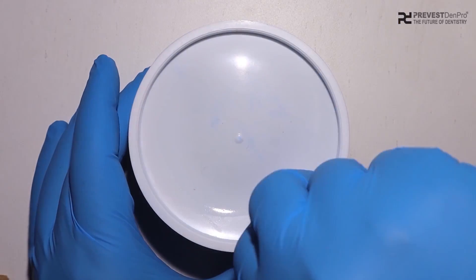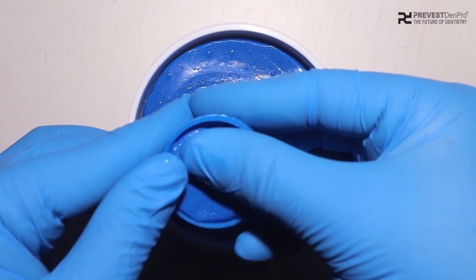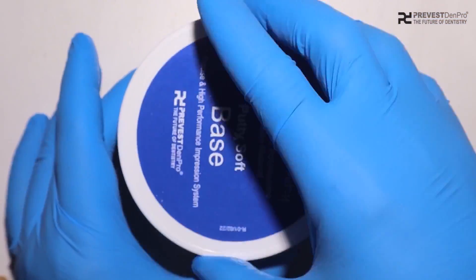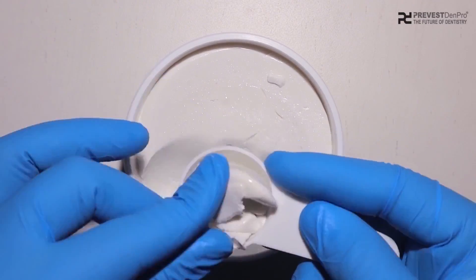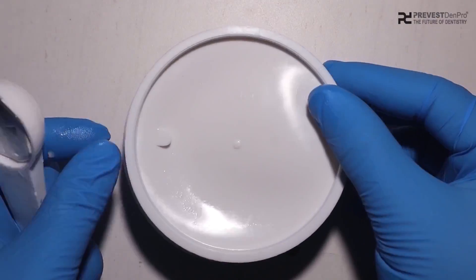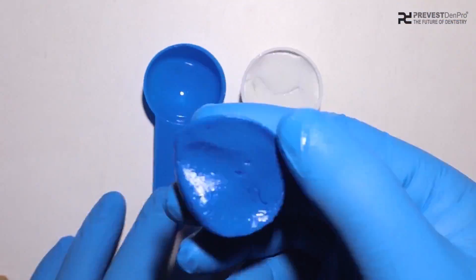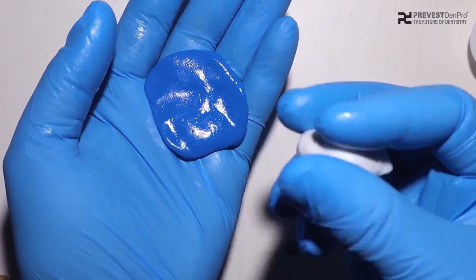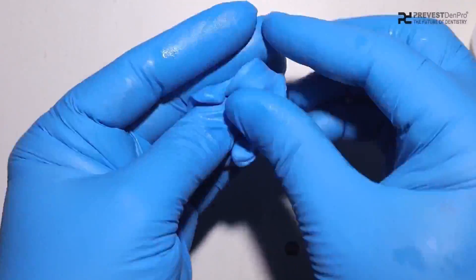We will use the Equisel putty base and catalyst paste. We will collect just a half scoop of base paste as well as the catalyst paste, and this is enough for the fabrication of a single unit crown. After collecting both pastes, we will form a palette with the base paste, then place the ball of catalyst paste over it and roll it inwards to form a uniform, homogeneous putty impression material.